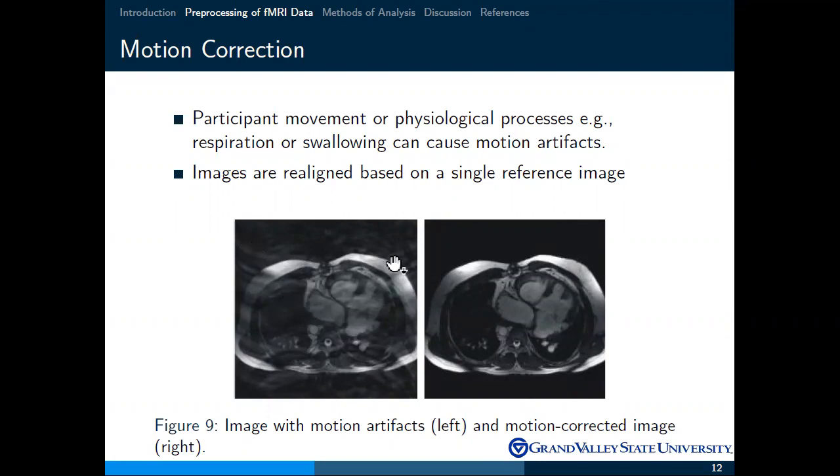that caused some somewhat faint but white bands to be displayed across the image. This was caused by movement, which sometimes can be the participant moving, or it can be as small as just the participant breathing or swallowing. Those types of things can cause these artifacts, which would cascade issues into analyses if you fit this right into a model without accounting for it.